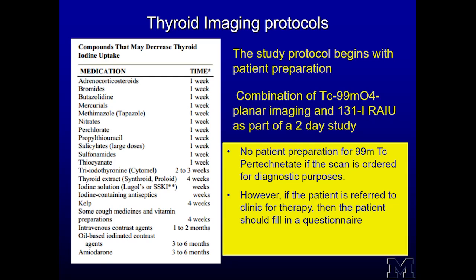for 4 weeks in order to allow the intravenous iodine contrast load to be eliminated. But this is again only in the case in which the technetium pertechnetate scintigraphy is done in conjunction with thyroid uptake testing in preparation for therapeutic administration of radioactive iodine for thyroid ablation procedure. If only diagnostic imaging with technetium pertechnetate is requested by the clinical service, then in that case, no special patient preparation is required. However, the radiologist needs to be informed about the medications that the patient is taking in order to provide interpretation of the scan in the correct clinical context.